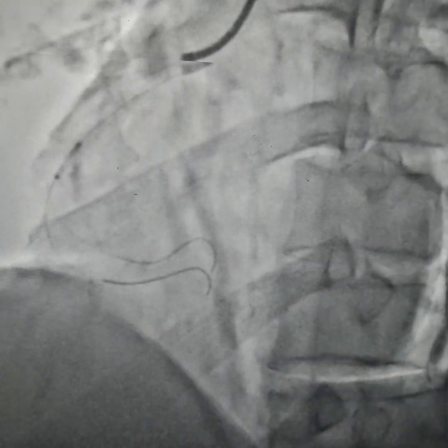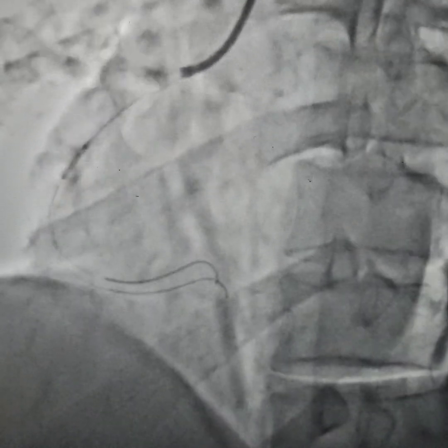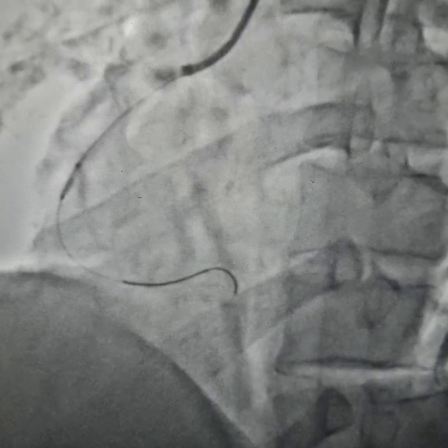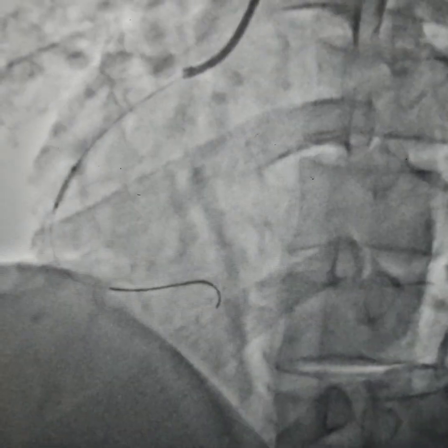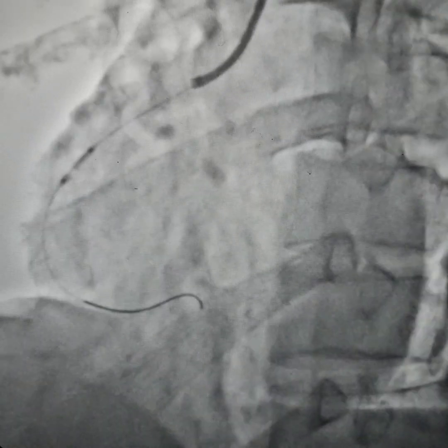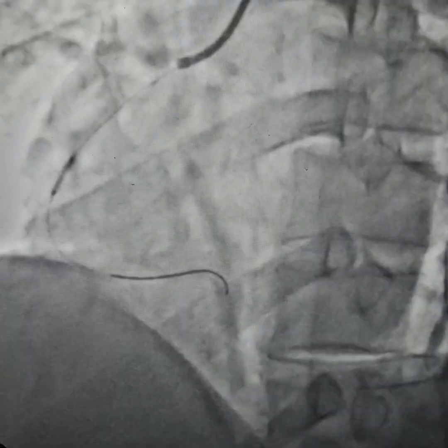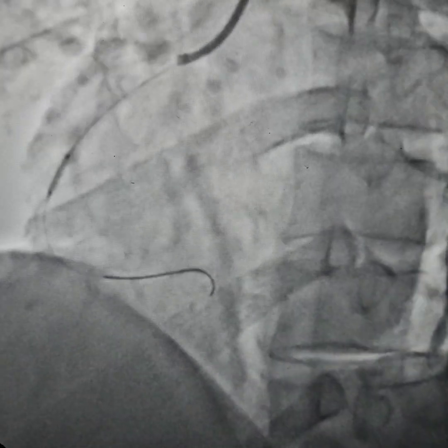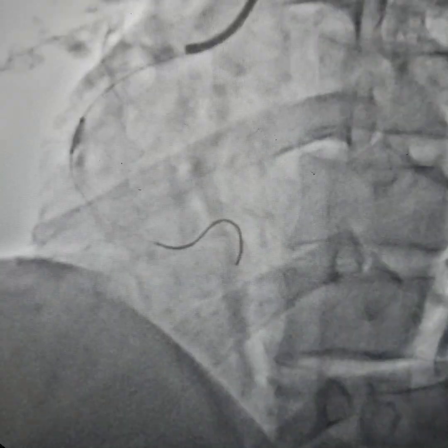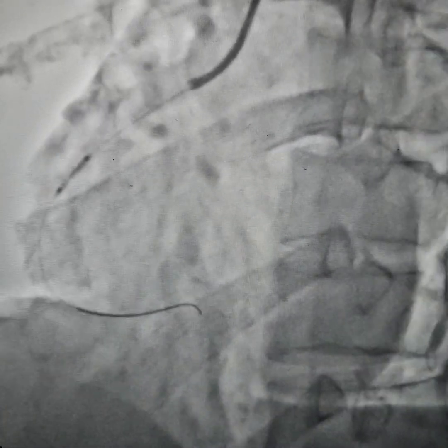Pre-dilation is very important in any case. We're using the 2 by 12 mm balloon for pre-dilation, then we use the 2.5 by 12 mm balloon for some additional pre-dilation.